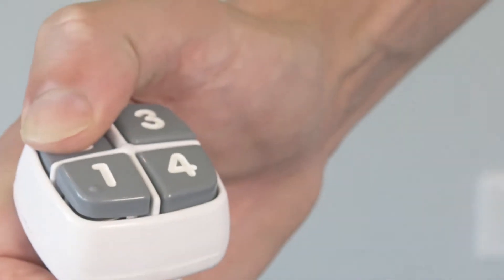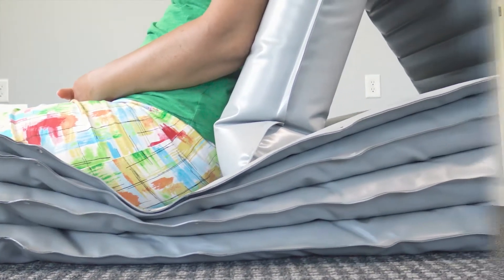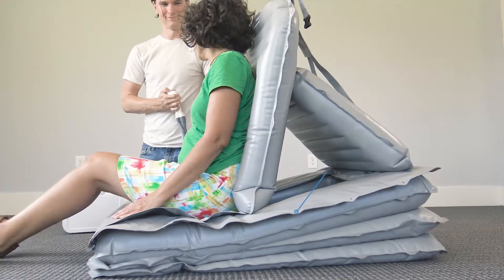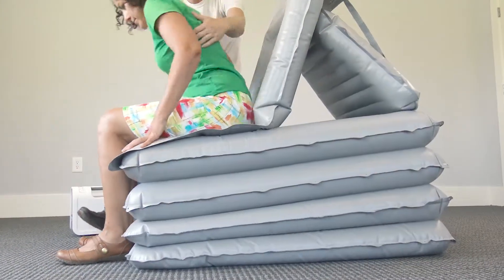Then press and hold number two, which will inflate fully until it becomes rigid, at which point the compressor will automatically stop. Continue with buttons three and four until the patient has reached a height where you can aid them in standing up.